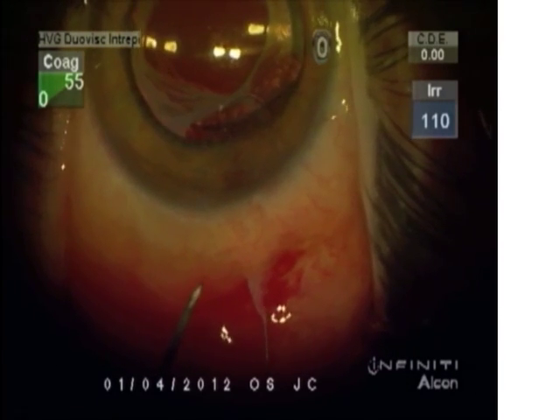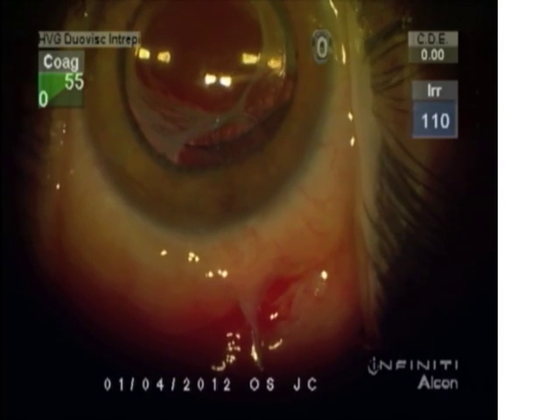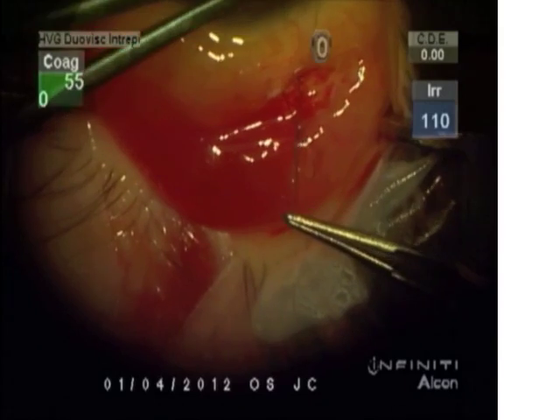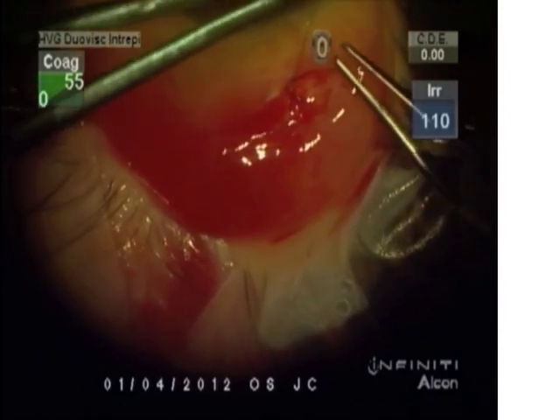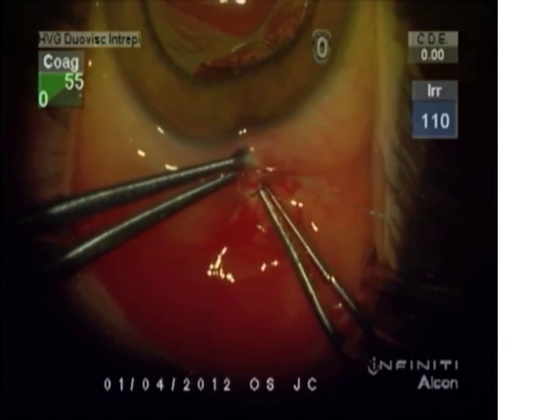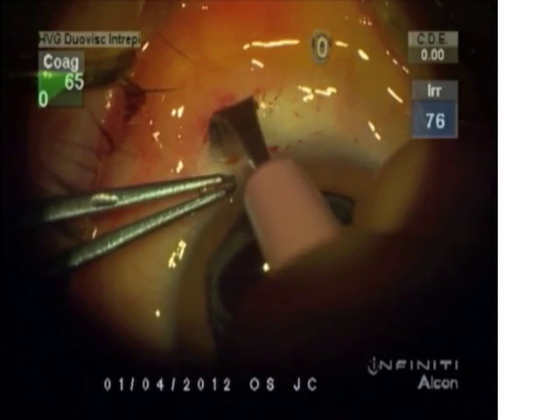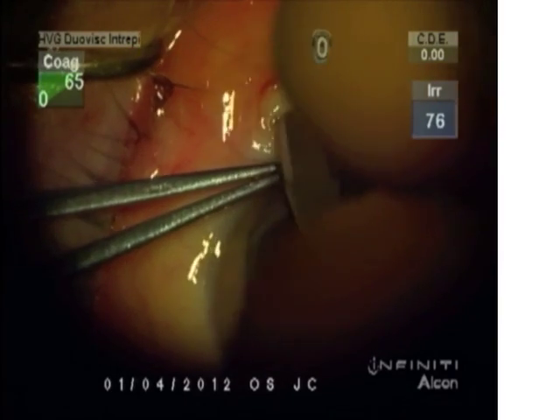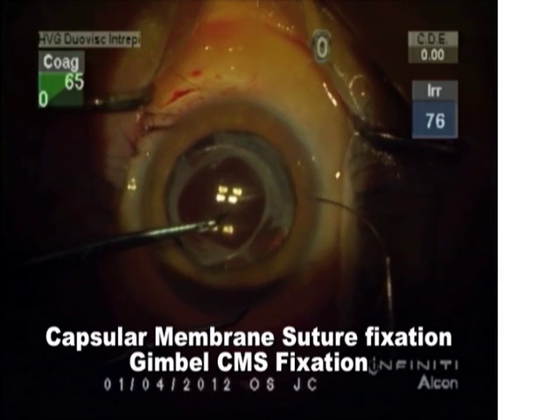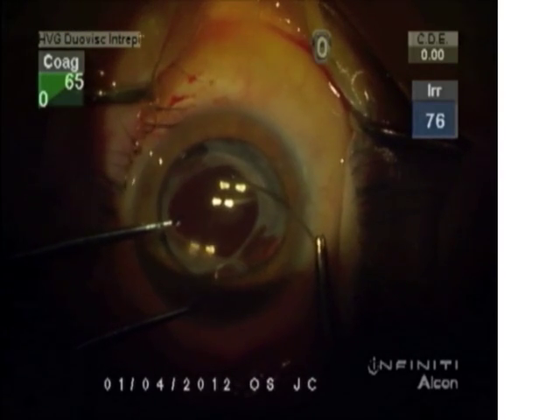As we pull this tight, you can see that the lens is subluxated a little bit inferiorly. I'm going to now use a technique that I've developed — a double-throw temporary suture that we've called capsular membrane suture fixation. The needle is tucked in and we're making a scleral groove, rather than a limbal groove, for the modified Hoffman tunnel. I like to stay away from the limbus for these peripheral sutures. We've termed this CMS fixation.